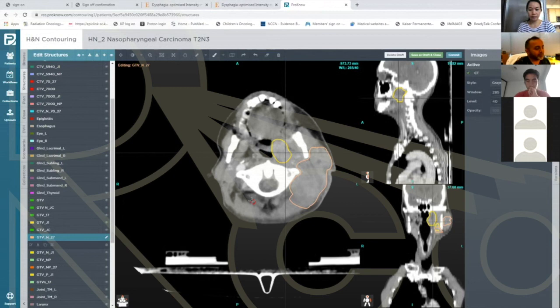I will say that this is where I probably come with an intermediate dose cloud. So I often will do a 70 gray volume that is truly to gross disease post-induction. And then I will do a 66 gray dose volume. So, I'll do 2.12 times 33 to the gross disease, 2 gray times 33 to the initial pre-chemo gross primary disease, and then 1.8 times 33 to the big elective volume around the nasopharynx. So I would just add another layer of dose.